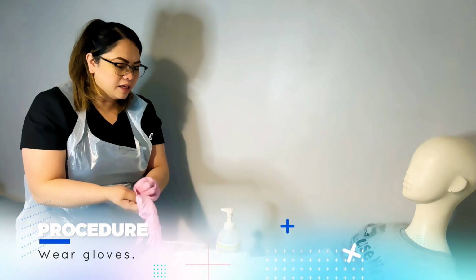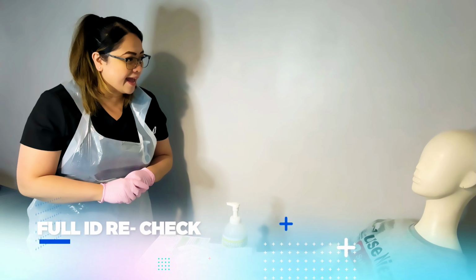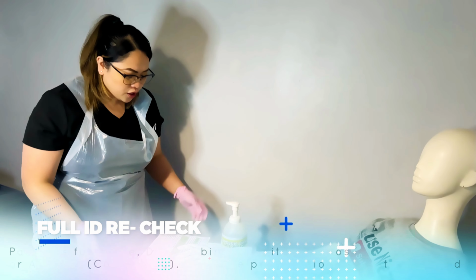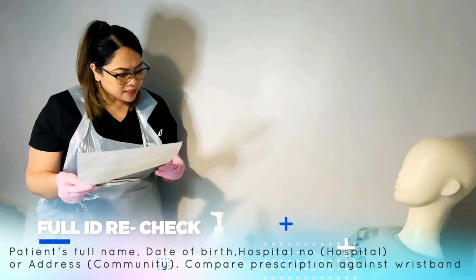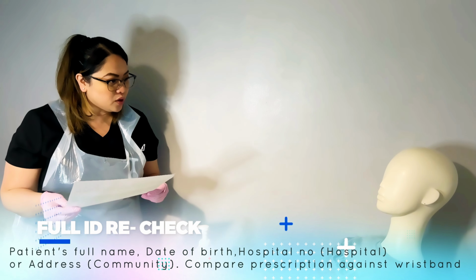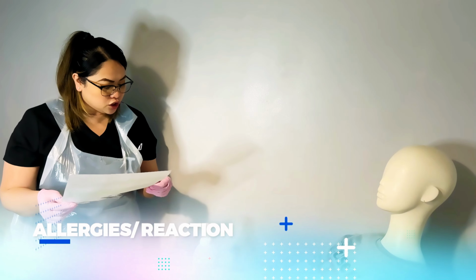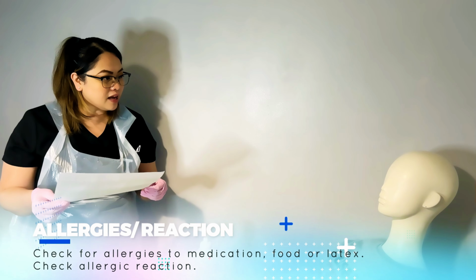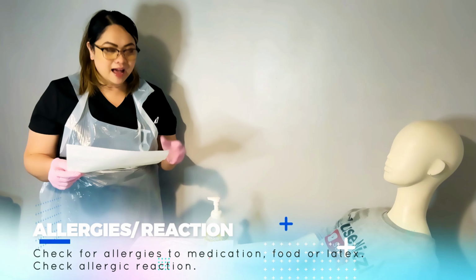Alright, Lailene. So again, here's the injection. But before anything else, would it be okay if I just check your ID again? Can you please tell me your full name, please? Lailene Consi. And your date of birth? 10 of the 1st, 1987. Can you tell me your address? 1000 Edinburgh Avenue, NR 317HA. And you said you have allergies to penicillin, yeah? Reaction for that, rashes. Okay, I can confirm that again, this is the same patient. Thank you so much for that.